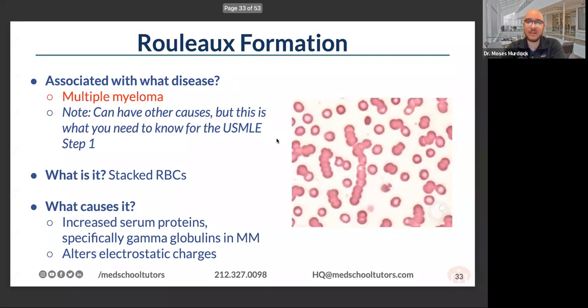And that's exactly right. This is multiple myeloma. And remember, in that first slide, I mentioned coming up with an illness script for some of these diseases. What are the clinical features, the lab features that would make you think of multiple myeloma? So if you had to, perfect, I see it in the chat already, CRAB, right?